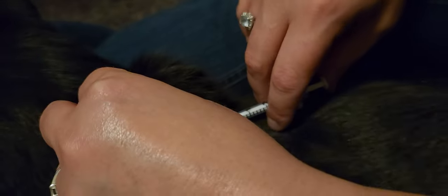Well, maybe not — he moved his head. I don't like to give the shot if he moves his head; I like to give it somewhere else. There — it's in. And he is all done with his insulin shot.